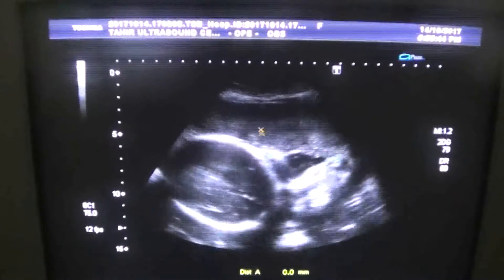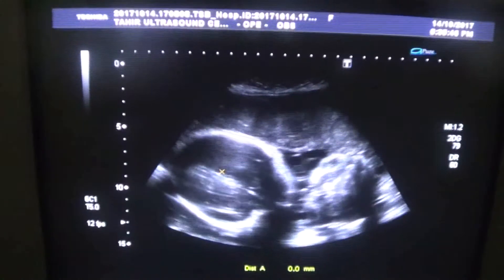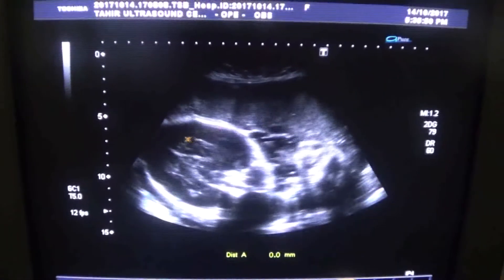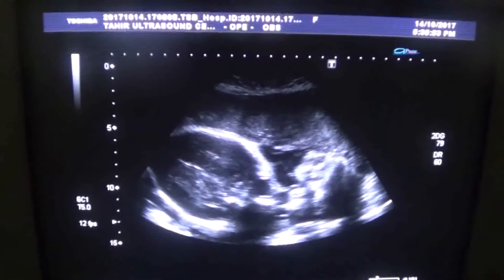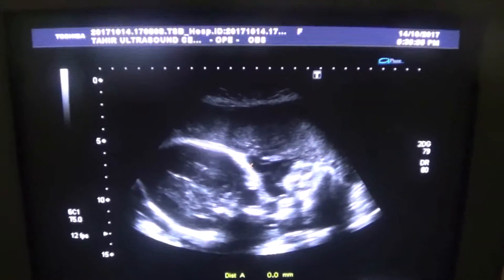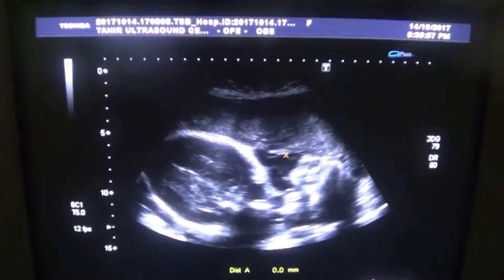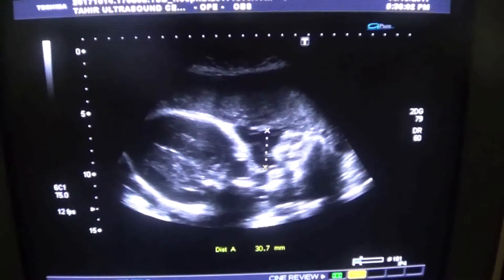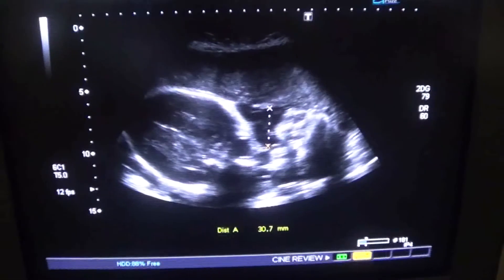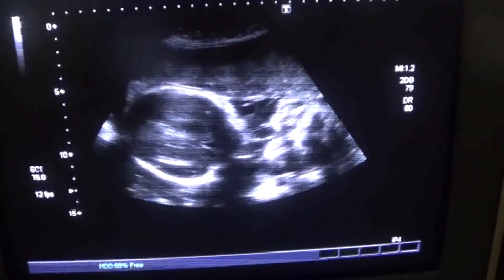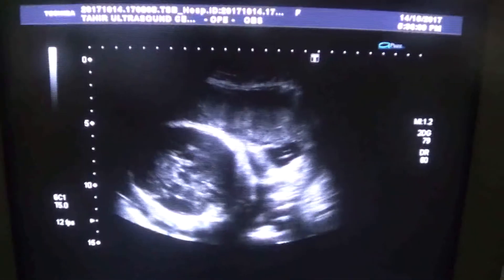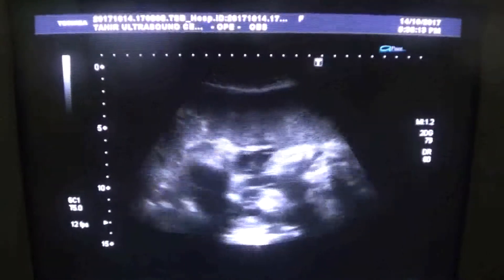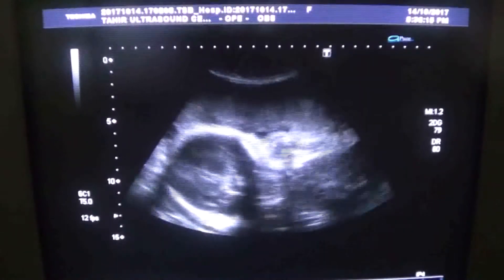This is the anterior placenta, the head of a 33-week pregnancy of a parous female. This is the only fluid pocket that is visible and it measures approximately 3 centimeters. It's almost in the category of anhydramnios. No pathology is seen relating to the head.